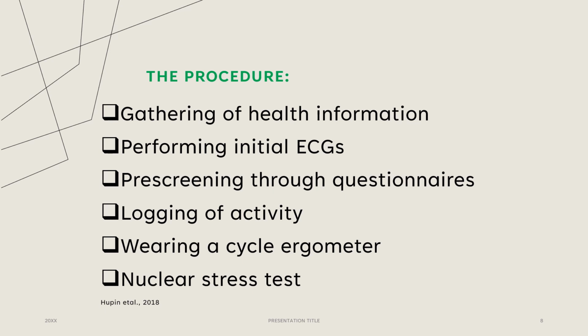Exercise-induced arrhythmias at the ventricular level had to be as frequent as greater than 10% of total QRS complexes or repetitive ventricular triplets or bursts. If a complete left bundle branch block appeared, it was an intraventricular conduction.